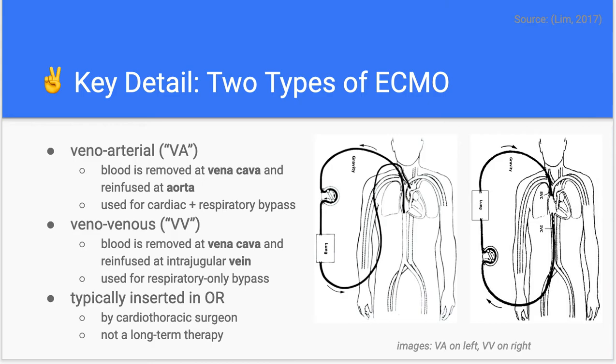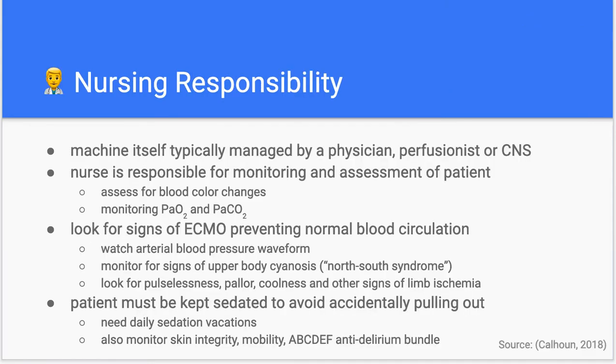So that gives you a little bit more detail about ECMO. So in the next slide, we'll talk about the nursing responsibility. So the ECMO machine itself is not normally managed by the bedside RN.